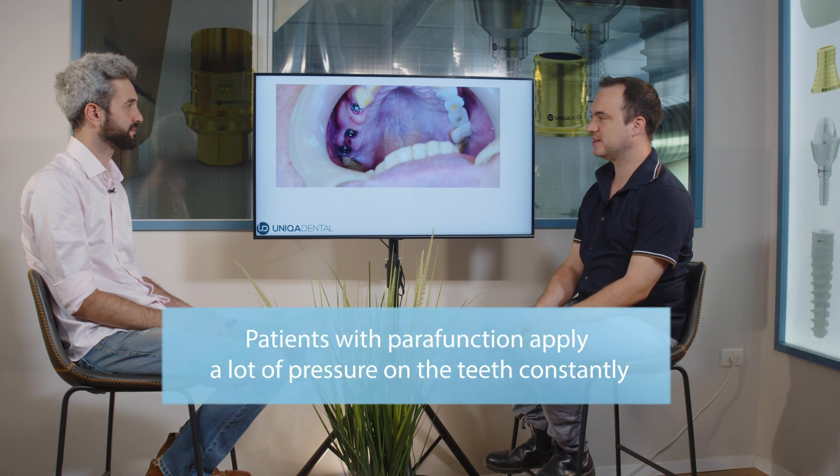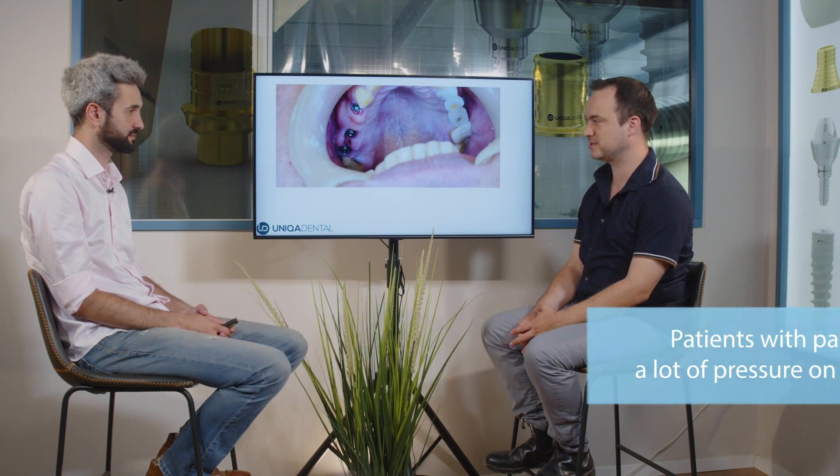The problem is that the patient has extreme parafunctional forces — he is a bruxist. He wears off all of his teeth and breaks down all the bridges. We always have a problem with the bridges because they are not holding the pressure and the amount of force he applies on them.